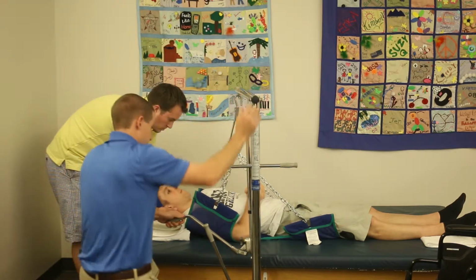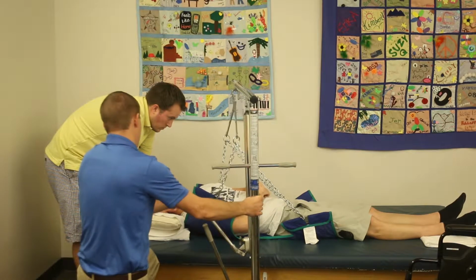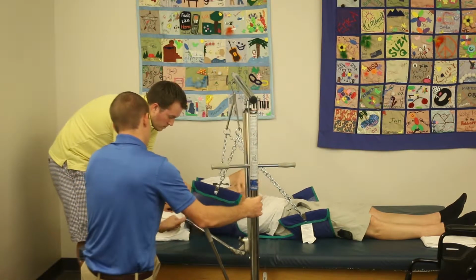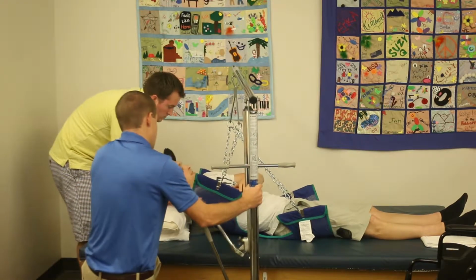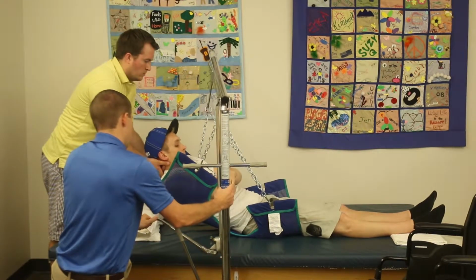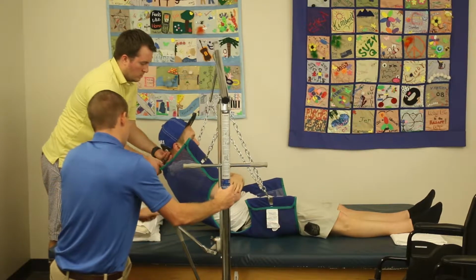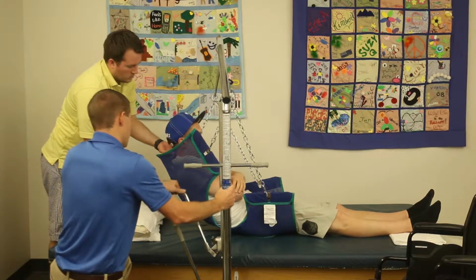All right, here we go. Still feeling okay? Just keep those arms folded just like that, perfect. I'm just gonna get you lightly suspended right there off the table, just enough so we can move you back and toward that wheelchair.